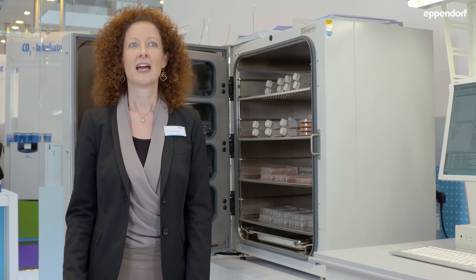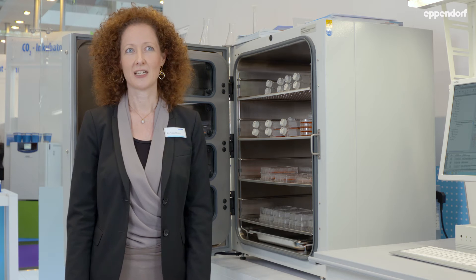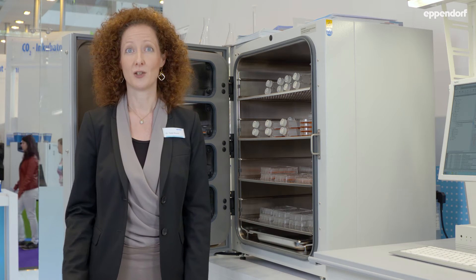Besides the right training of all colleagues that have access to the cell culture labs, thorough working is the most important thing. That means you have to clean and disinfect the whole equipment on a regular basis, especially the biological safety cabinet, the water bath, and the incubator.